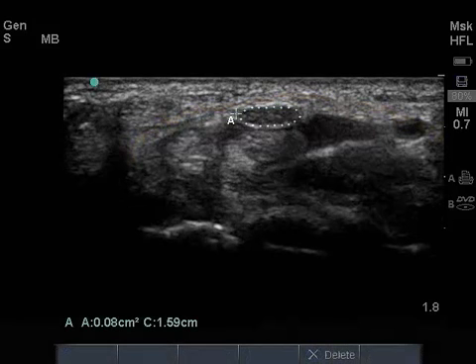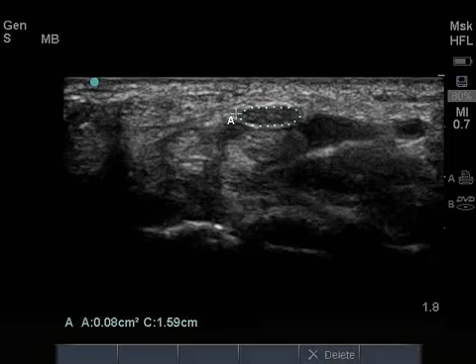After identifying the median nerve at the wrist crease, freeze the image. Using circumferential trace mode, the cross-sectional area of the median nerve at the proximal carpal tunnel should be measured. Normally, the median nerve should be uniform in caliber and measure less than 10 mm square.